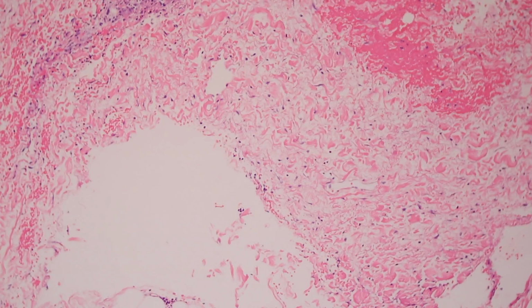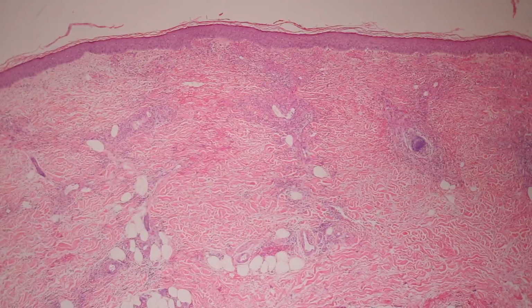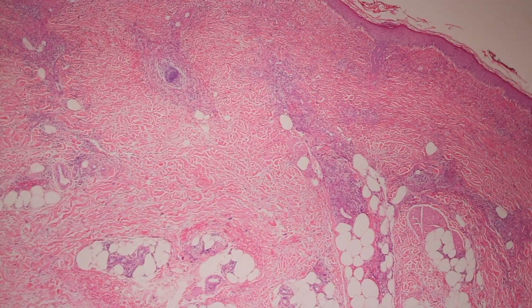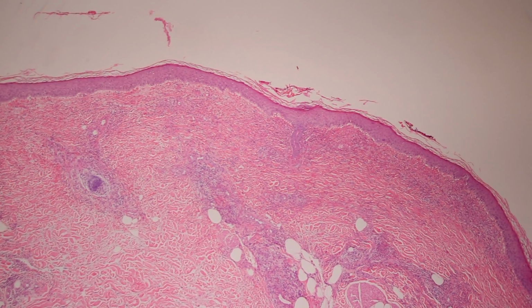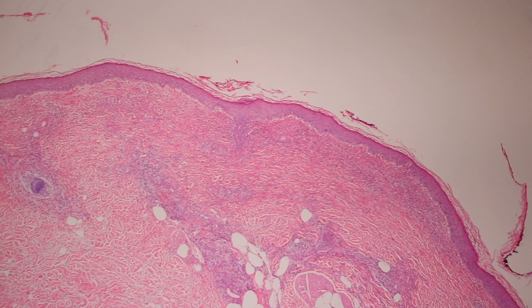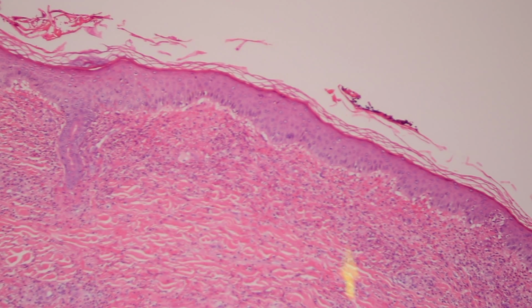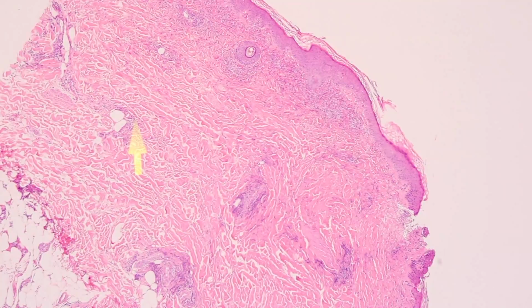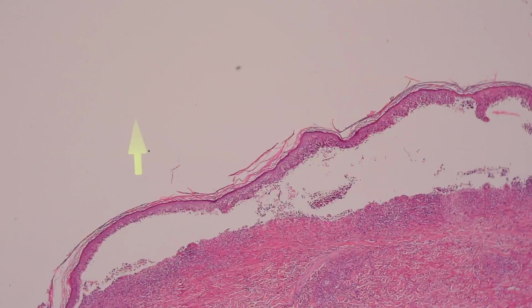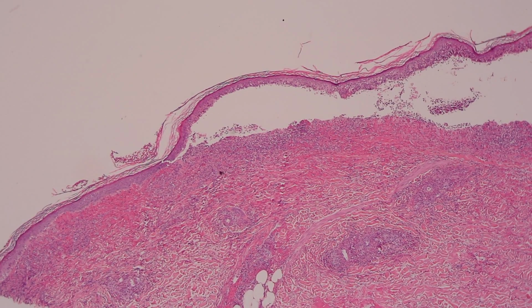And when neutrophilic vasculitis or leukocytoclastic vasculitis involves a lot of deep dermal vessels, you begin to get damage to so many vessels that you develop some ischemia in the skin. There's not enough blood flow, and the epidermis is particularly sensitive to making sure that it has enough blood flow. And when it does not get enough blood flow, it starts to die. And you can see here that there's so much neutrophil and fibrin deposition here that we're starting to get little bubbles underneath the epidermis, at the dermal epidermal junction there. And if we look over at a different piece, there it is, you can see in fact that the damage has become so robust that it's detaching the whole epidermis and making a blister.